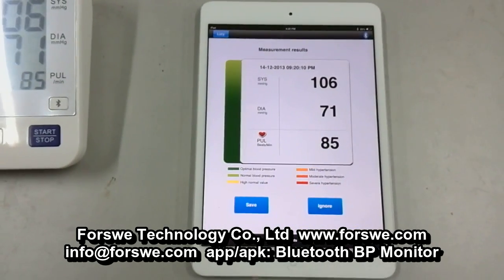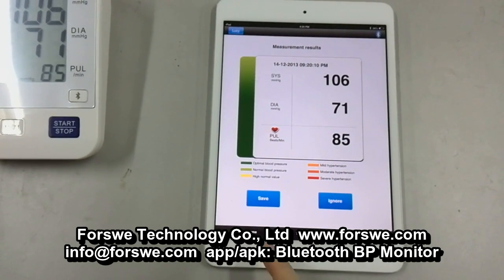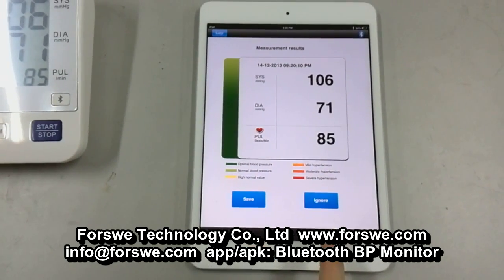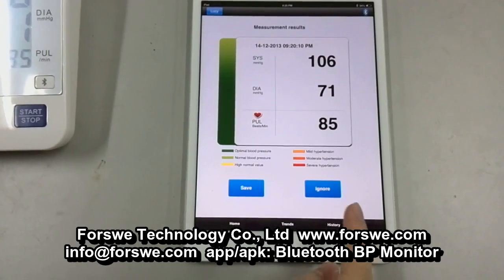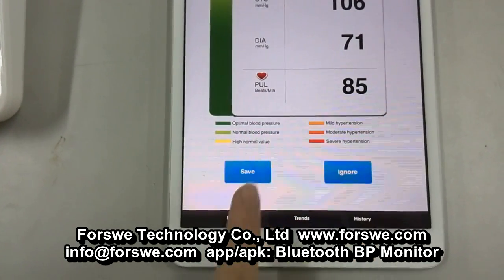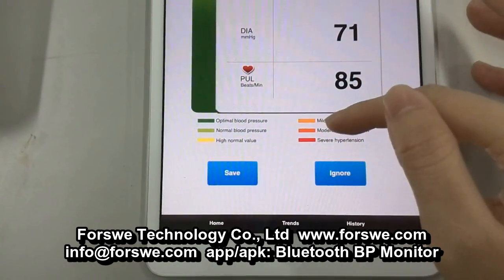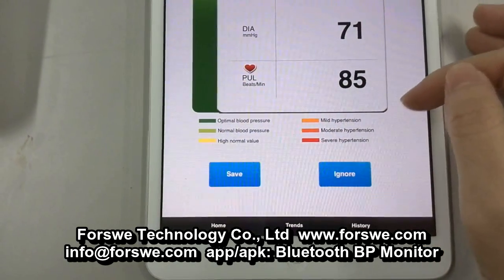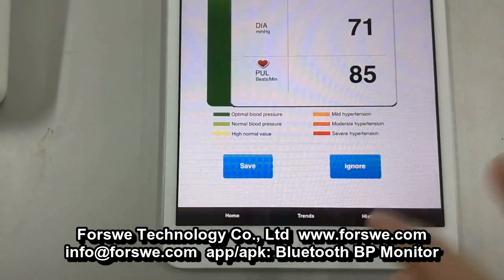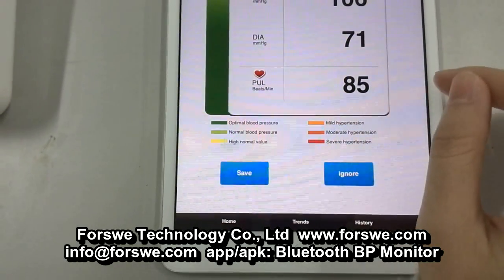Now it's finished. If you want to save the records, just press the button Save. But if you want to delete the record, just press the button Ignore. Now click the button Save. In this page, you will see six different colors, and each color stands for a different blood pressure trend.